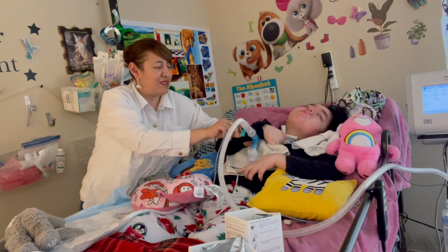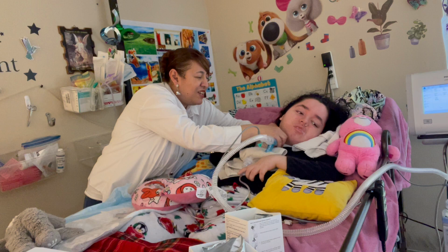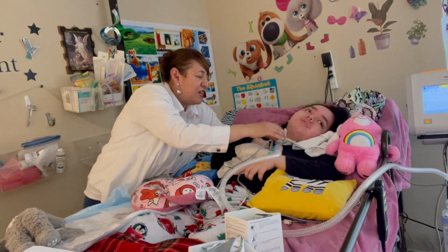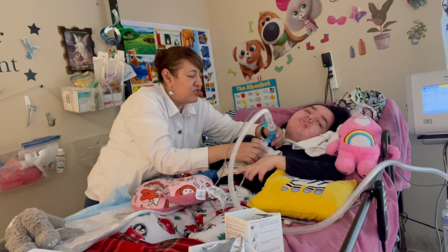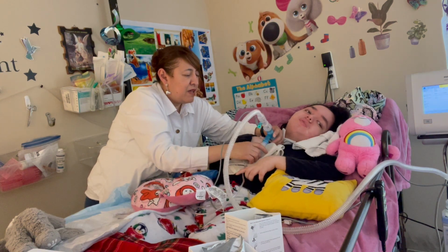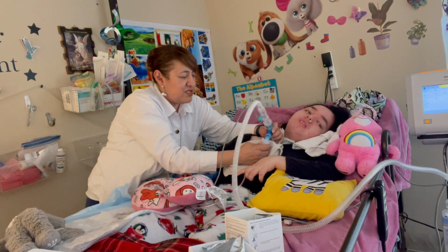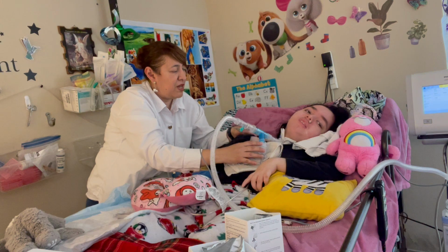See, she disconnects her trach, her trachea tube, but it doesn't matter. We can put it back again. She doesn't like this, but she has to have it so she can breathe, right, Maryanne?